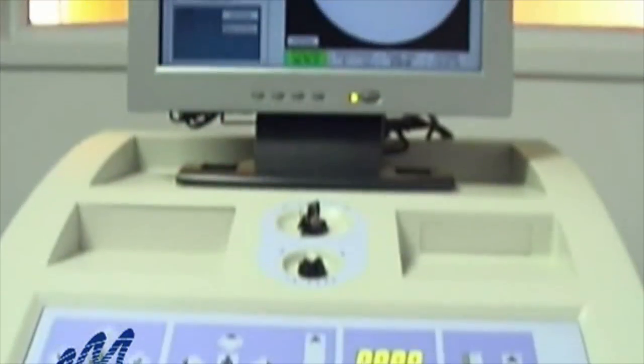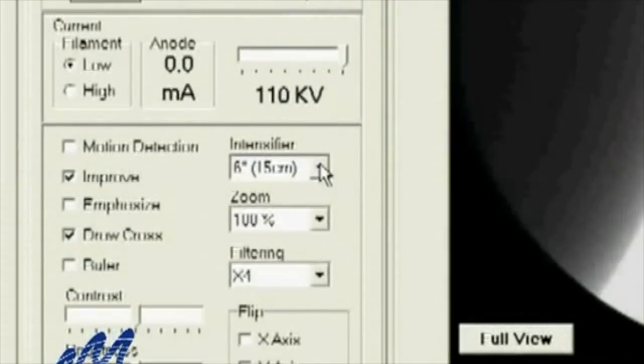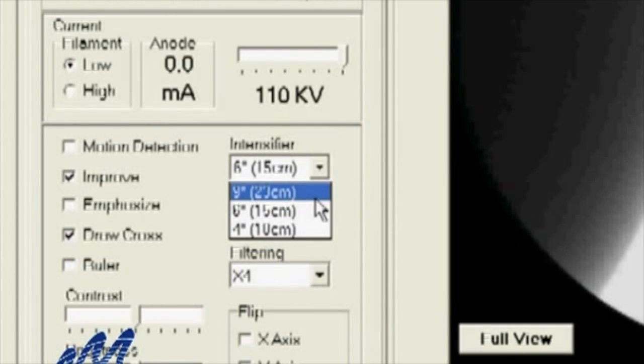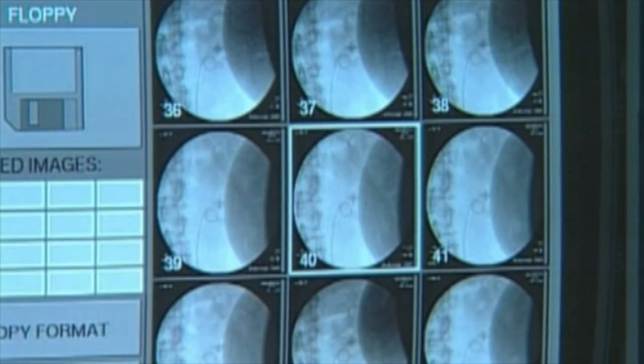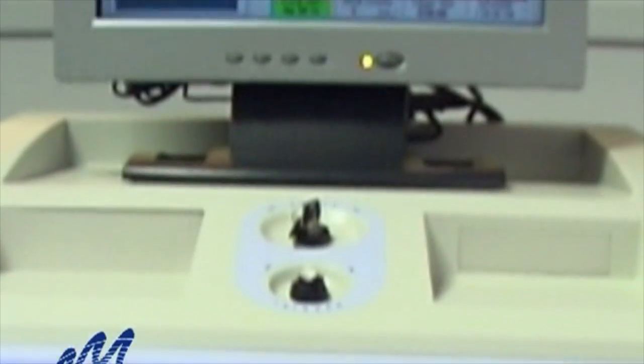MediSpec's optional MediConsole provides advanced software-based system control along with powerful data management, an automatic stone localization feature, real-time stone measurement, multi-stone presentation, a dynamic on-screen ruler and other unique features.